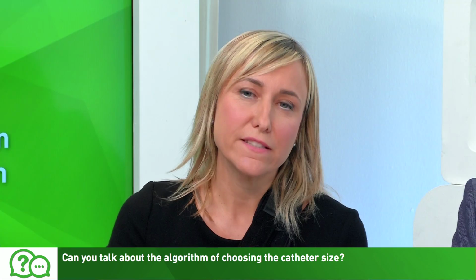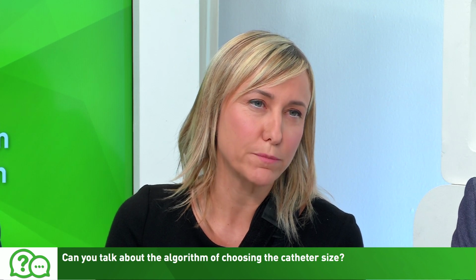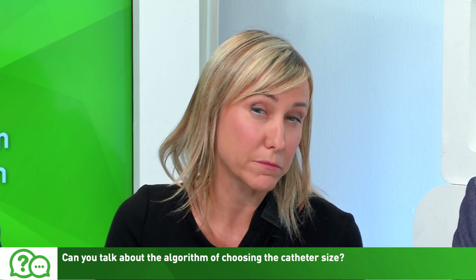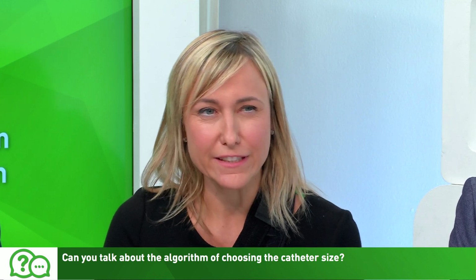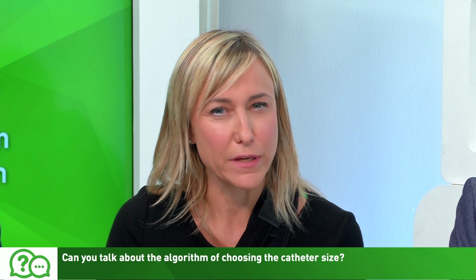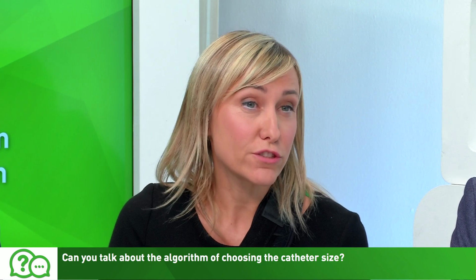Yes, in this phase and in both cases, if they are critical, it's going to be provisional stenting. SYNTAX score is going to be low. So theoretically, this is one of the indications for PCI of the left main. So guiding catheter, in this case, 6 French, because it would be a provisional stenting.